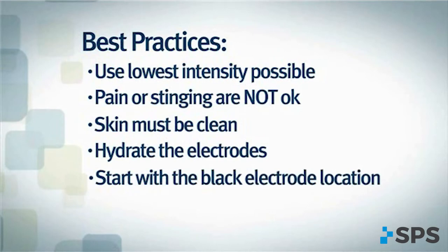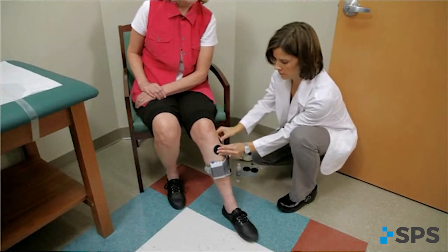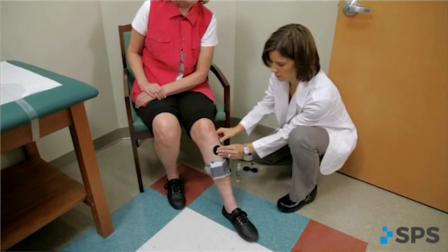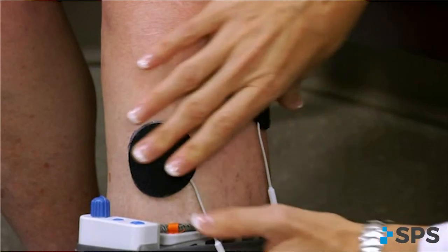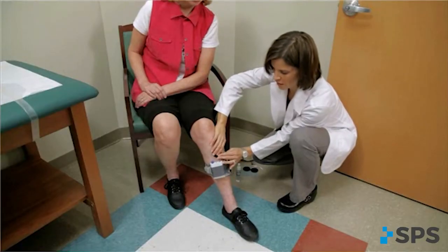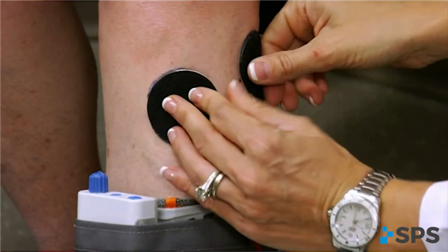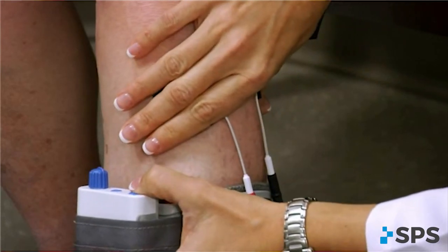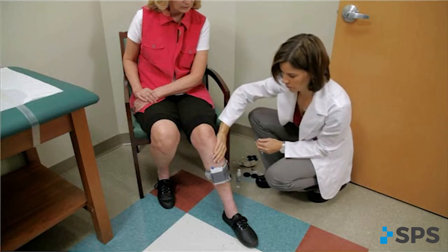Always begin by identifying the starting point for the black electrode, then adjust the spacing between the black and red electrodes or their positioning to achieve the desired foot lift. If the contraction is not optimal initially, consider using the exercise mode prior to final placement of the electrodes to wake up the neural pathways. Make small movements when shifting the electrodes to detect subtle changes in muscle contraction or function. Leave the electrodes on the skin until final placement is identified to prevent dissipation of the water and to maximize user comfort.